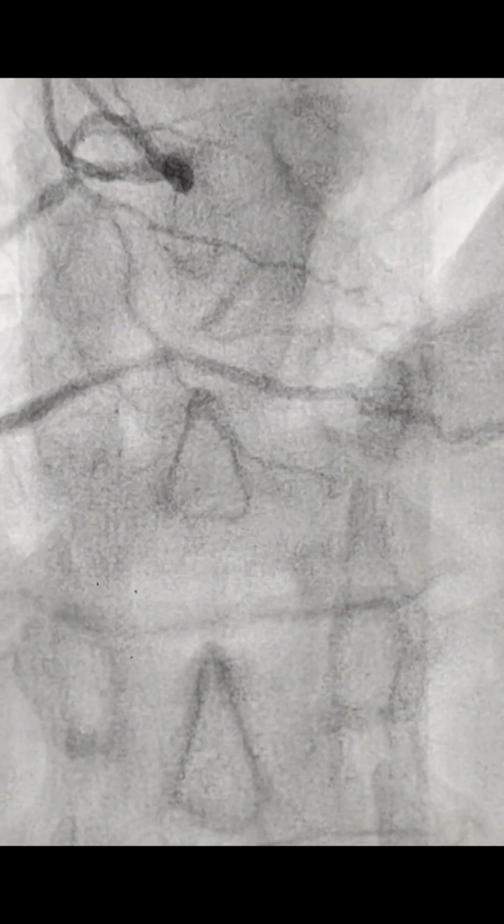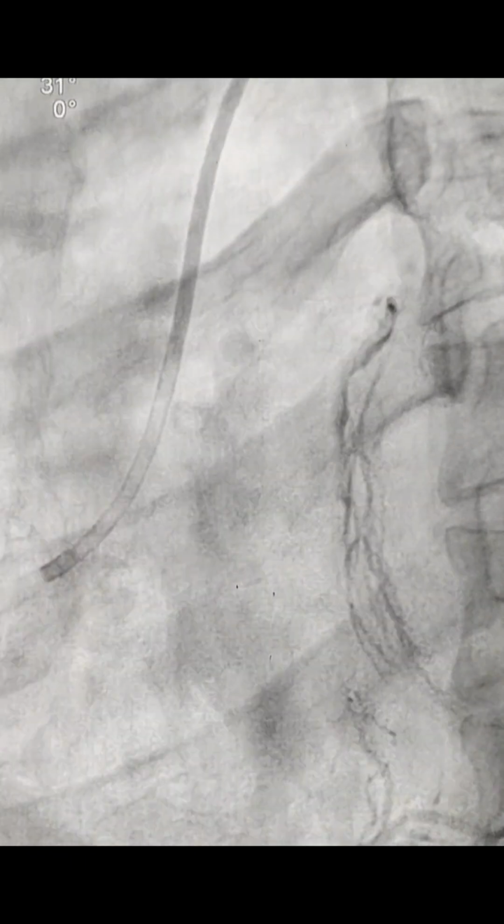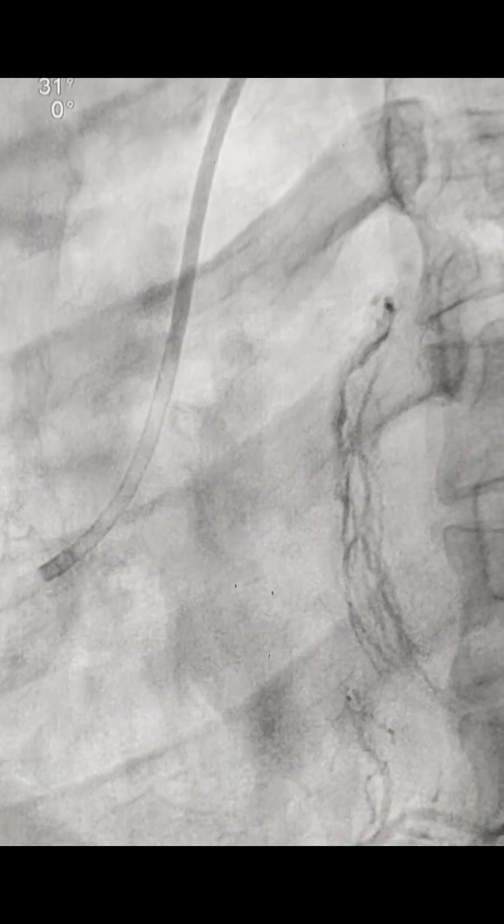This is the distal LAD, retrograde filling. So as the patient was stable and LV function was normal, my plan was to do provisional stenting to this bifurcation at the PLV, PDA, because there's an ostial lesion at the PLV. So right from the RCA to PLV, I'm going to put a provisional stent, and then we'll do the POT and all. And then one stent will be put in the mid RCA where the lesion is, and then we'll try the CTO of the LAD.